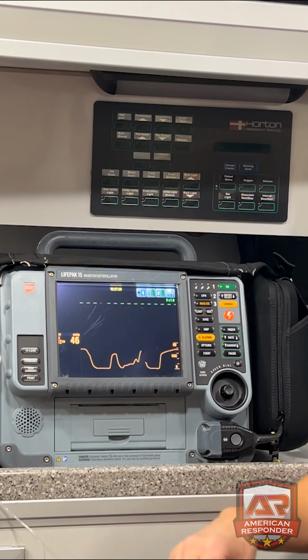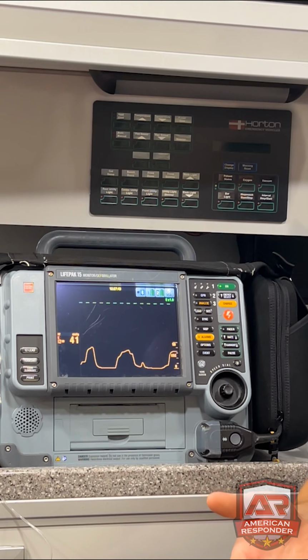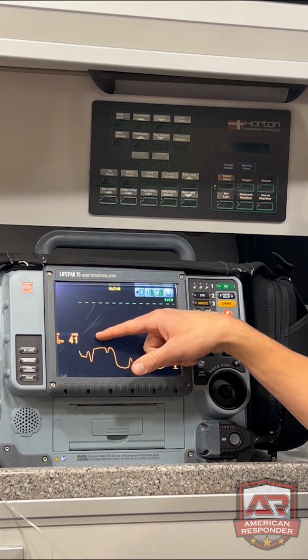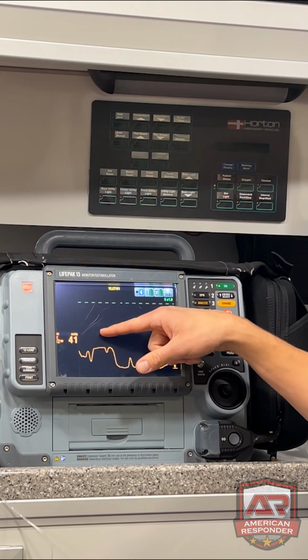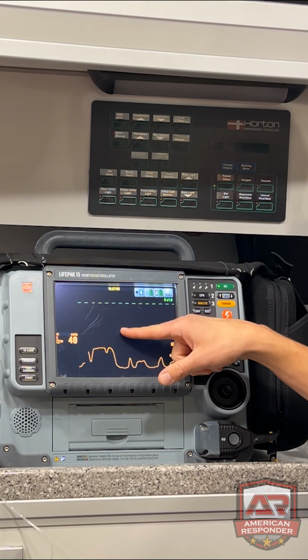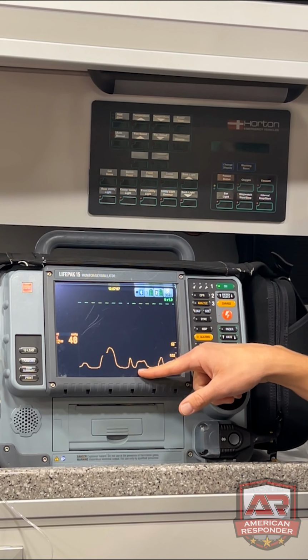As you breathe in, it makes it go down. If you breathe out, that's expelling the CO2, and that makes it go up. So as it goes up, that's me breathing out the carbon dioxide, then it plateaus, and then it goes down when I breathe back in.